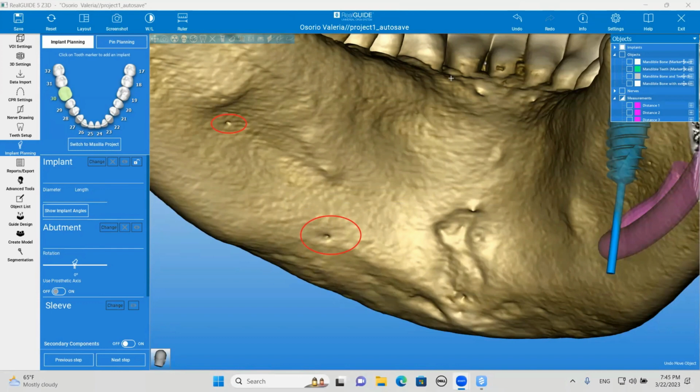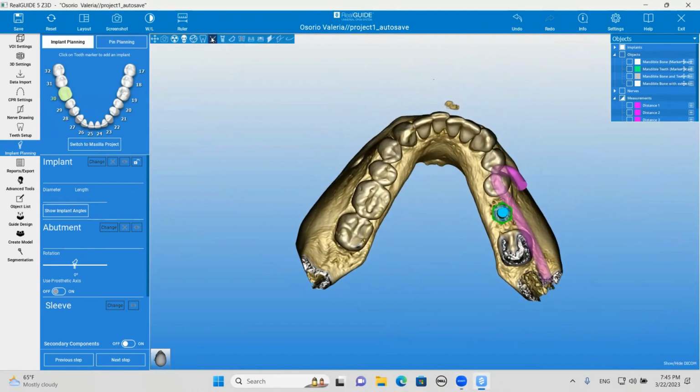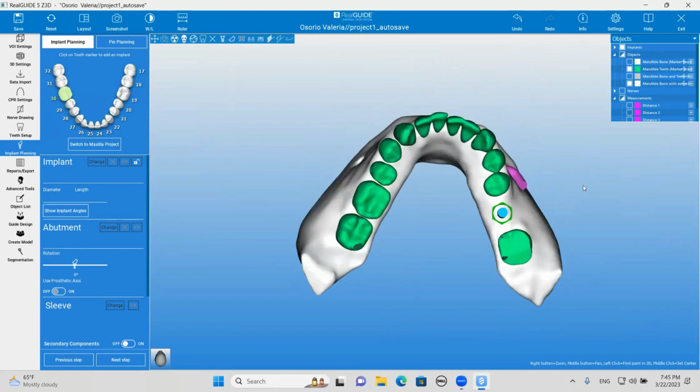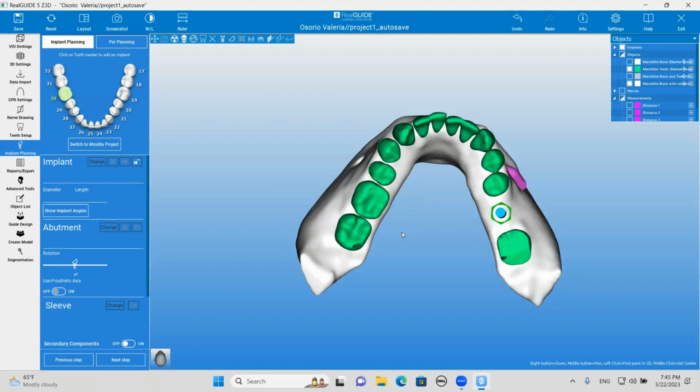Okay, but those usually go to the teeth, and they give the nutrients, either the nerve, artery, and/or vein. Okay, so anything else on this one? Jimmy, do you have any questions or any other comments on that? Well, not related to this case, but the previous case, you talked about decortication for some buccal graft. I was just wondering, apart from scraping the cortical plate on the buccal side, do you want to drill a few holes through the buccal plate, or just scrape the bone?